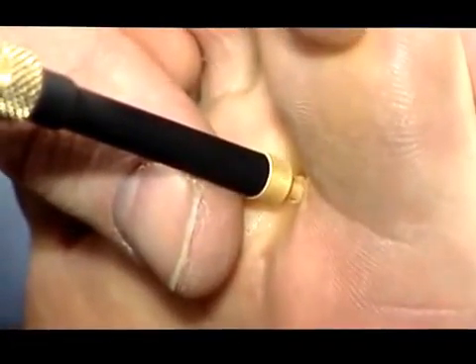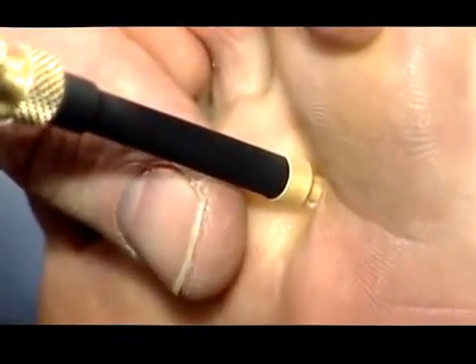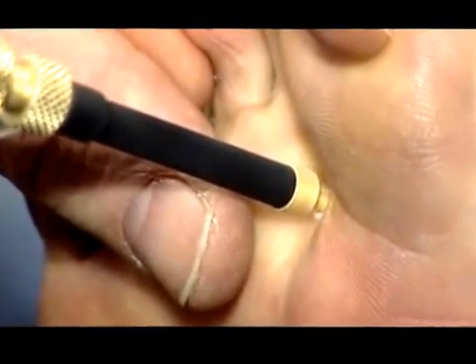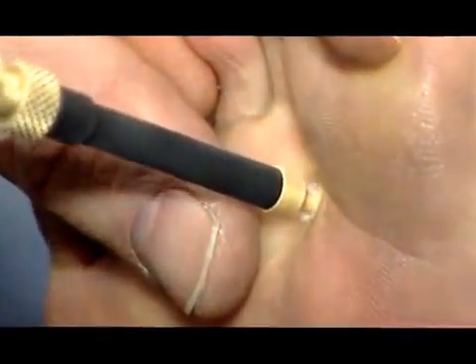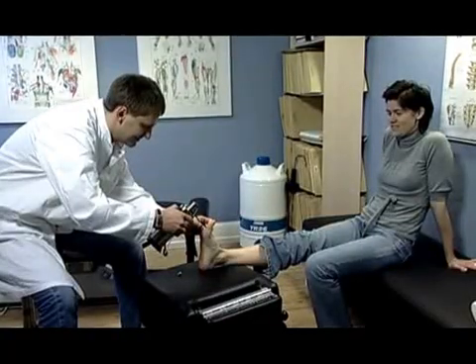After a few seconds, the probe adheres to the skin, ensuring optimal skin contact and heat transfer. Keep freezing until a 1mm frozen halo is seen around the probe. Then release the trigger and the probe will come off in a few seconds.